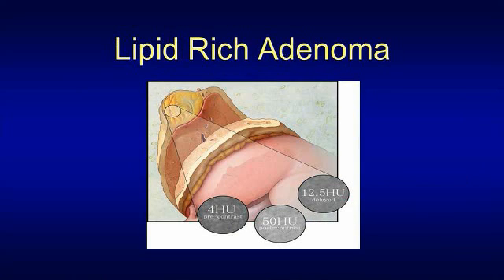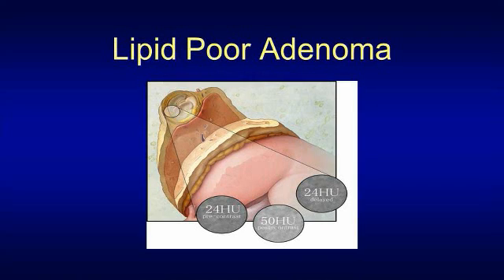Most adenomas are lipid-rich with a low density on the pre-contrast scan, but whether they are lipid-rich or lipid-poor — as in this case where the pre-contrast density is 24 Hounsfield units — adenomas take up contrast quickly and then wash out quickly from the venous to the delayed acquisition. That's all for now. The next topic I will present is when do I have to perform a gated chest CT.